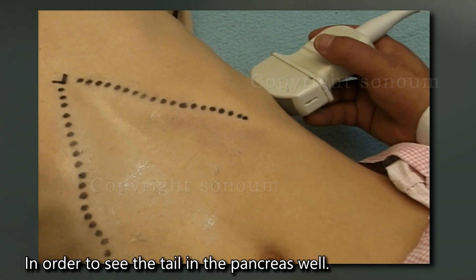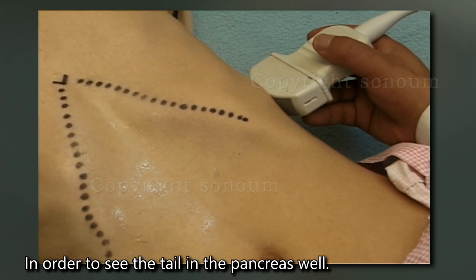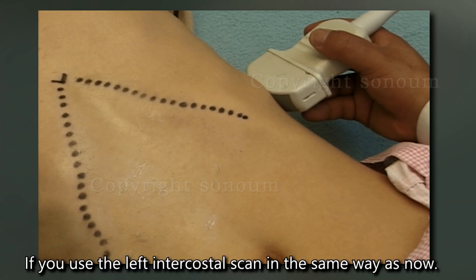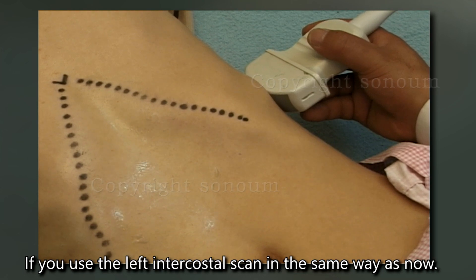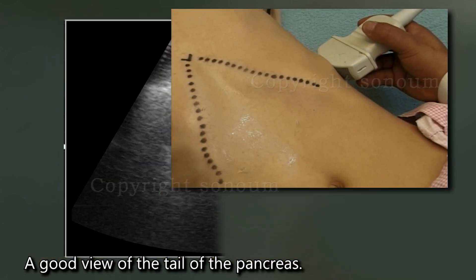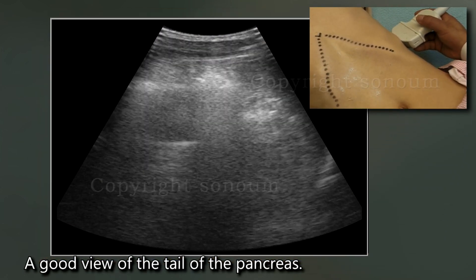In order to see the tail of the pancreas well, use the left intercostal scan in the same way as demonstrated to get a good view of the tail of the pancreas.